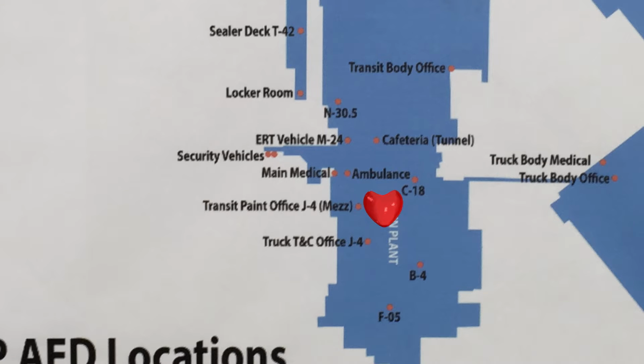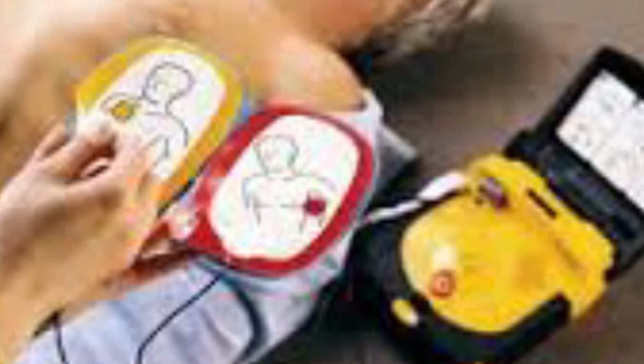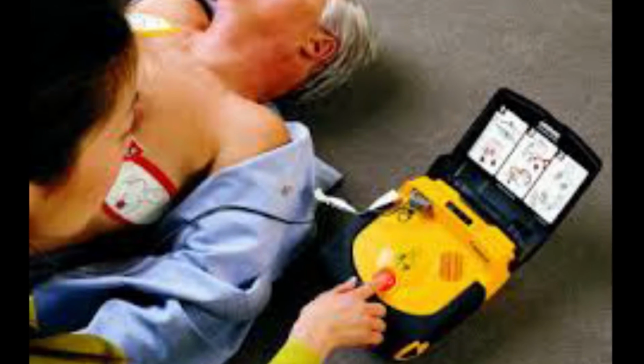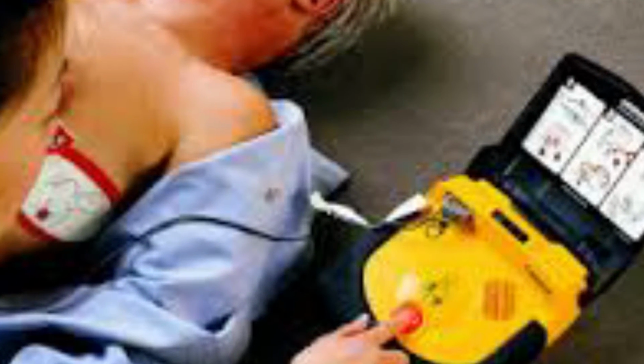She started chest compressions. Two bays away there is a restroom that has an AED. The people in the area said there's an AED at that restroom, so they went and got it, brought it over, turned it on, got the pads out, and put it on. In the meantime, I took the gentleman's coveralls and shirt off while Mary continued chest compressions. We did not have a mask with us, so we did not do any breaths, but when I put the AED on, almost immediately it said a shock was required. So we cleared everyone away, applied the first shock, and started chest compressions again.